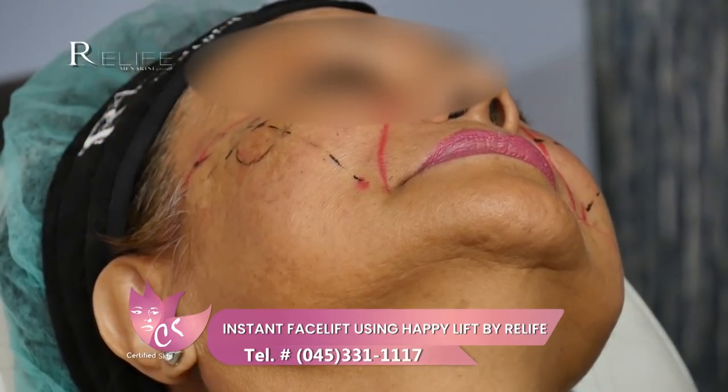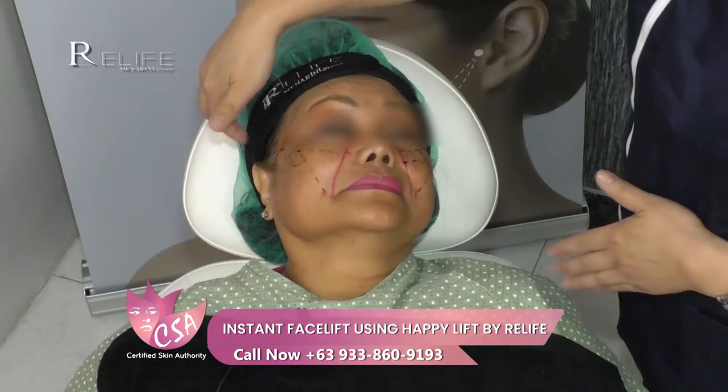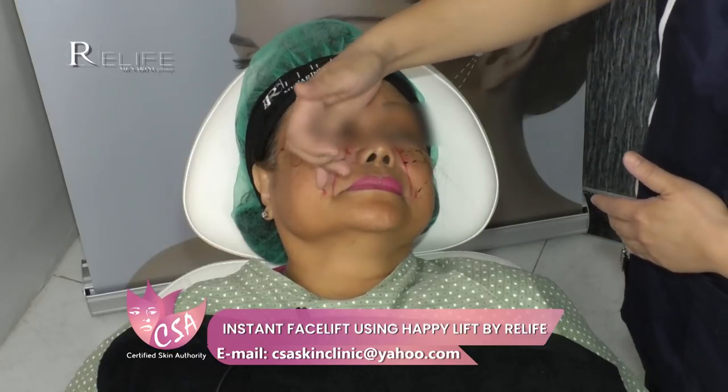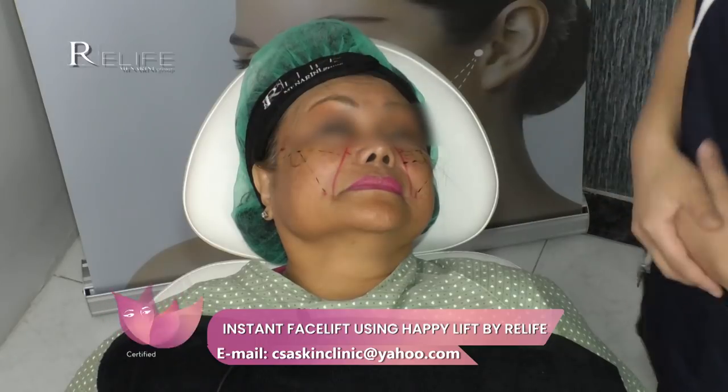It's very important to place these safety lines because there are vital structures we have to avoid — branches of the temporal blood vessel, temporal nerves, and also the facial artery branches in the midline area, medial to safety line number two.